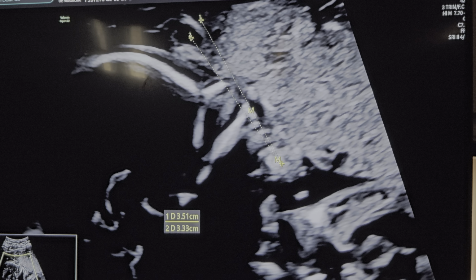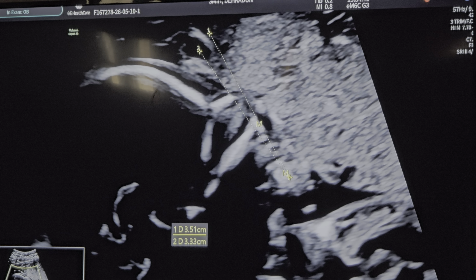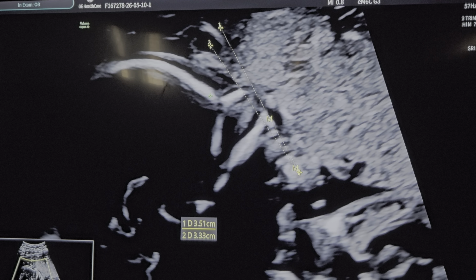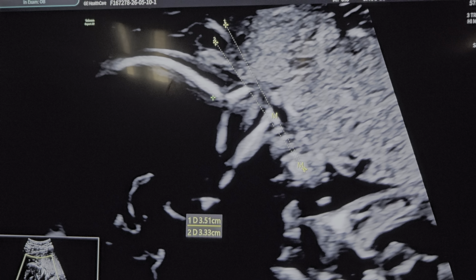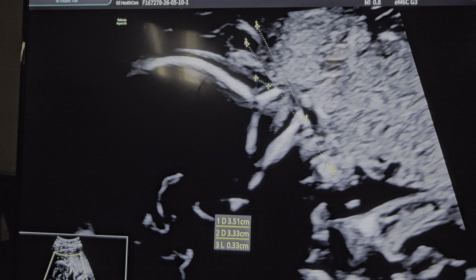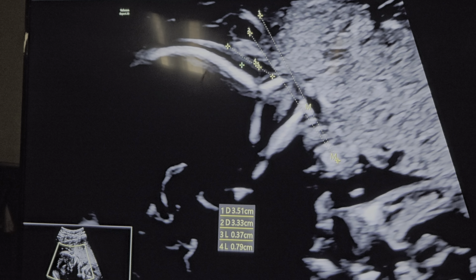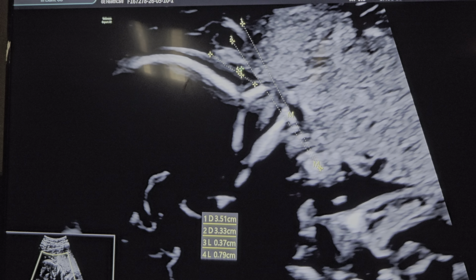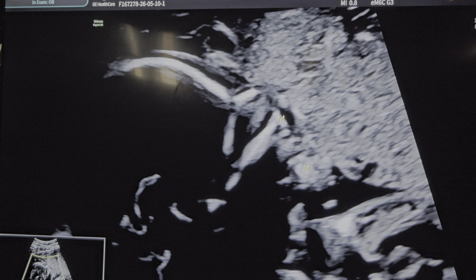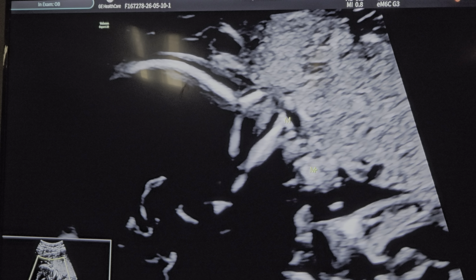Now the second important thing in a Down's child, I am drawing you an important parameter. Now you can see the frontal bone, you can see the nasal bone. At the fronto-nasal junction, you can see the subcutaneous edema here. This is the prefrontal edema. This prefrontal edema is increased in Down syndrome and the maxilla is small. So what I do, I just take the baseline as the mandibulomaxillary line.